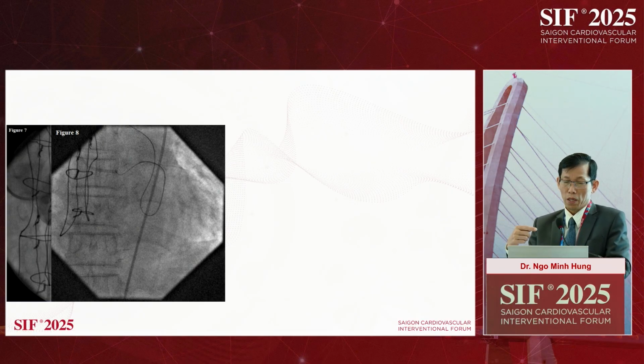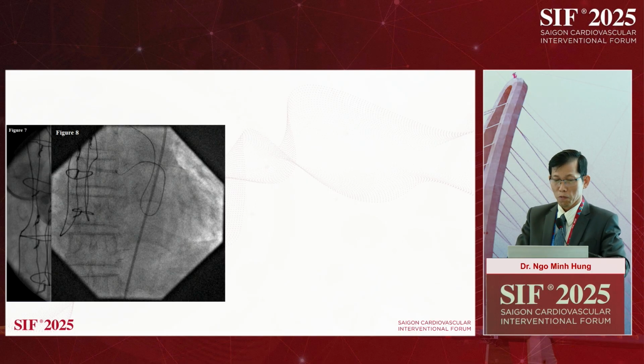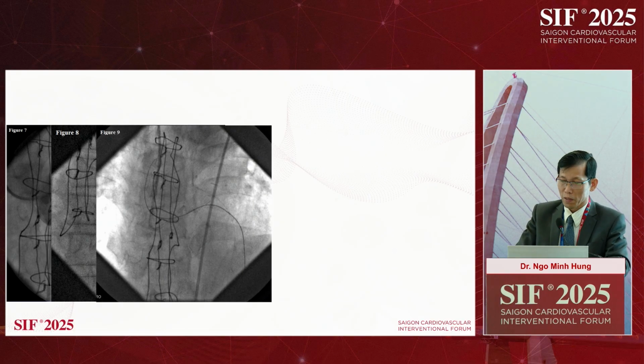I think we had to go direct to the aorta, but we don't know where to puncture in order to poke. So finally I used another wire, a strong wire. If we had the Gaia 4, maybe I would use the Gaia 4, but at that time we had only the Conquest Pro. I think I used the Conquest Pro 20, but now there is no more Conquest 20.